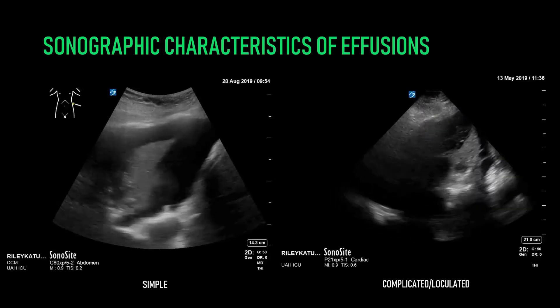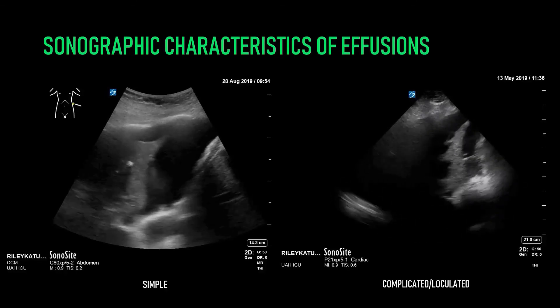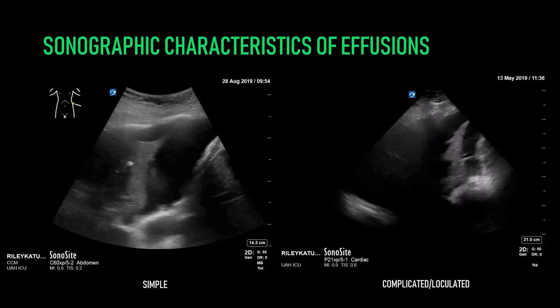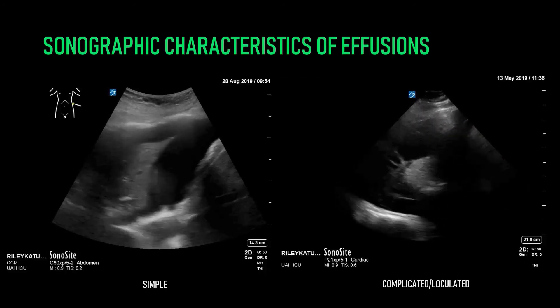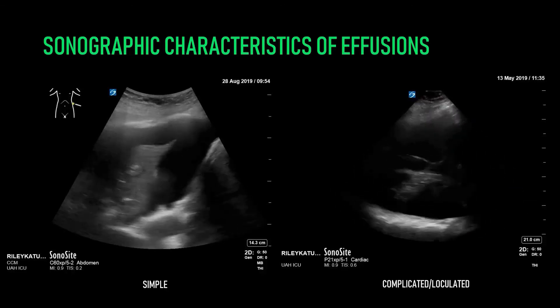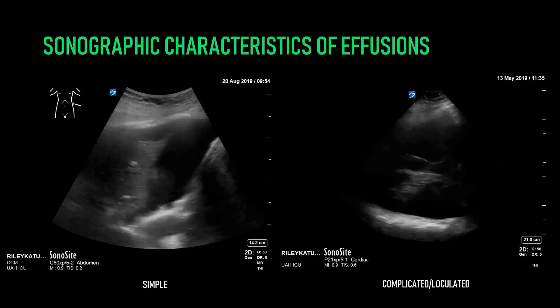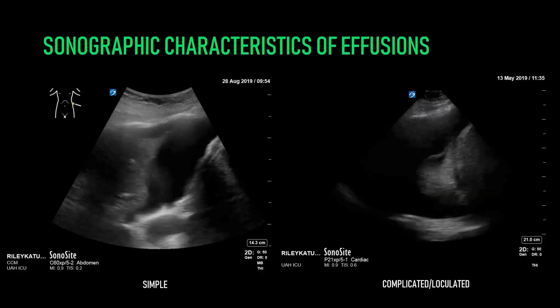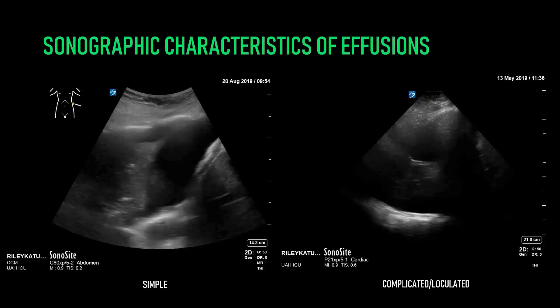Ultrasound, in addition to identifying the presence of an effusion, can also help to characterize it. This is relevant because different types of effusions may be more or less successfully drained via a small-bore percutaneous catheter. On the screen left, there's a classic simple-appearing effusion — a purely anechoic space in the pleural cavity with no evidence of septations or loculations. On the screen right, you can notice multiple bizarre, mobile, linear structures in the pleural cavity. These are called septations or loculations, and by definition make the effusion complicated. They're strongly suggestive of infection in the pleural space.